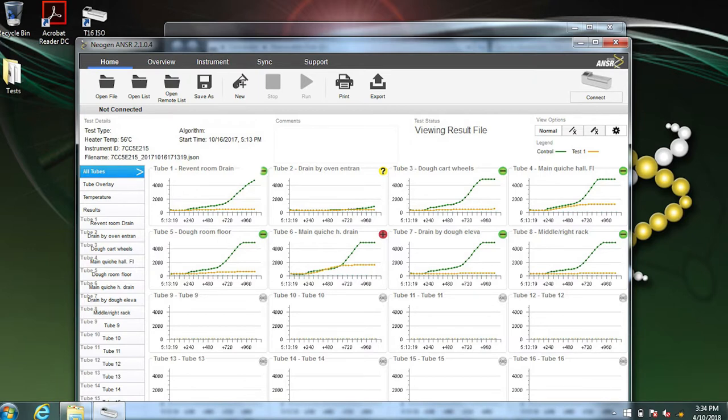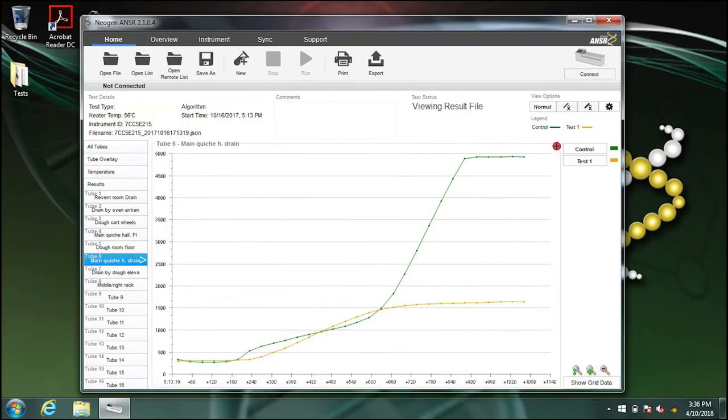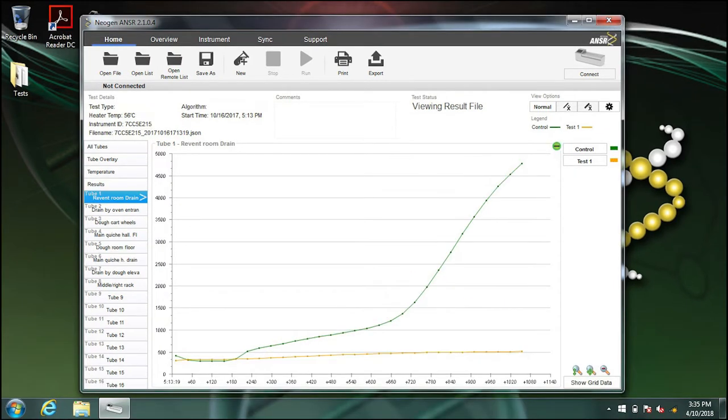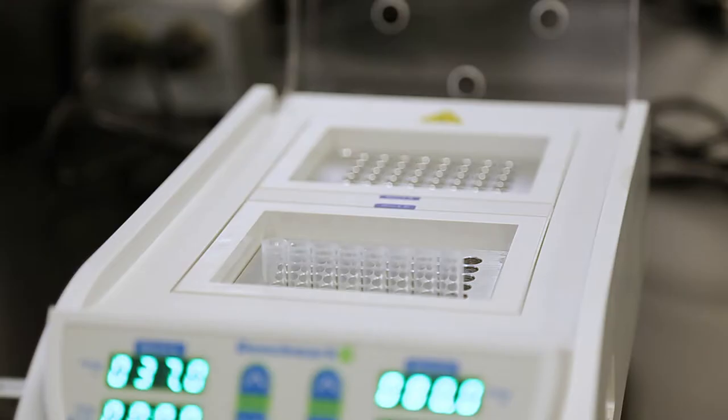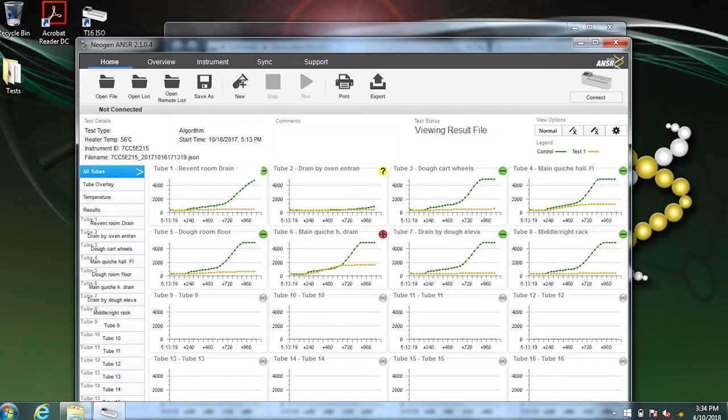Test results. You will see the results appear on the computer screen in real time. When the reading finishes, the results display as a presumptive positive or a negative. You don't need to interpret the results. In the case of an invalid, which appears as a question mark, you must run the test again using the retained samples. The final step is saving the results.